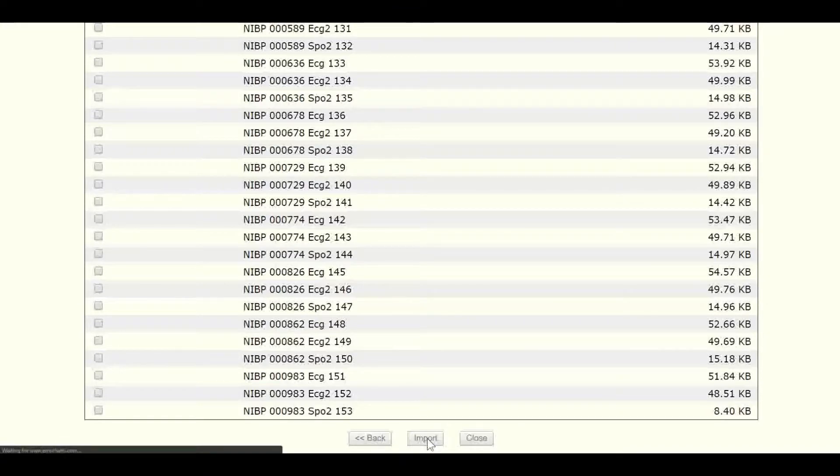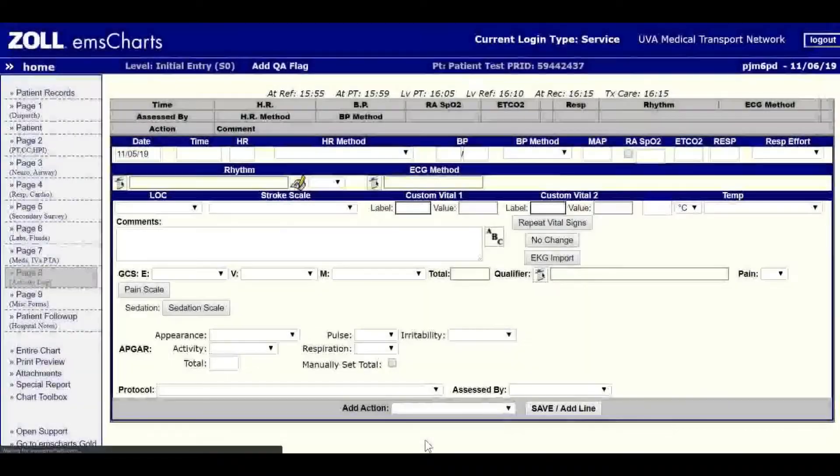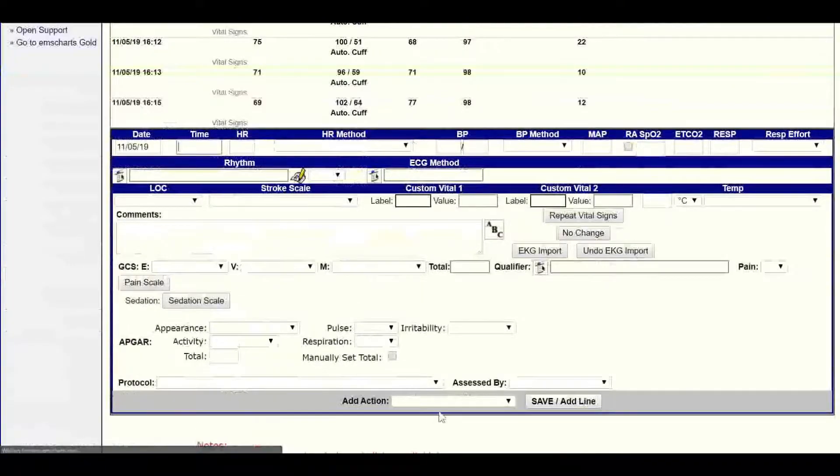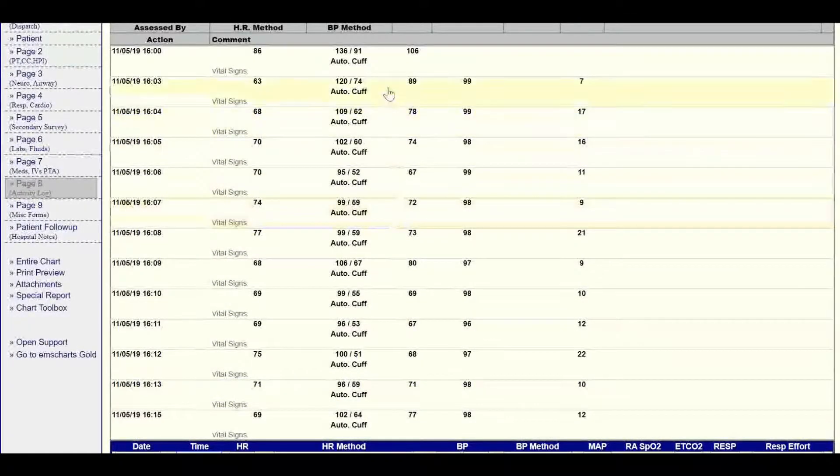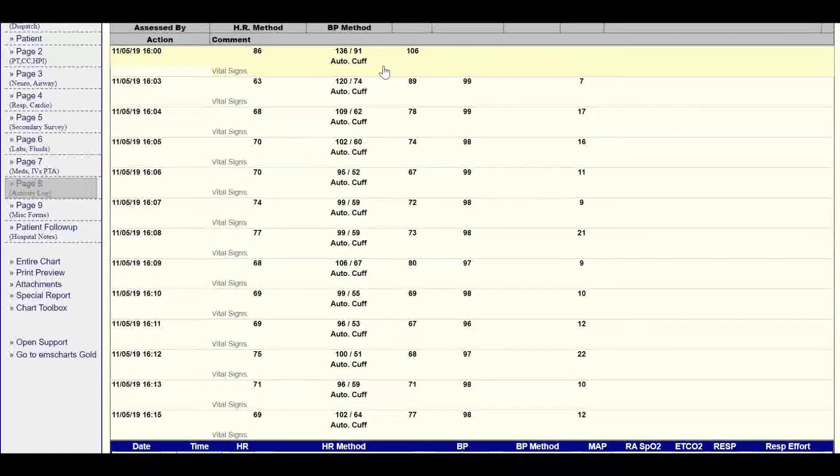You'll then click Import when you're ready. After some time, you'll be presented with page 8 again, where you'll see a list of all your vitals beautifully imported into EMS Charts.